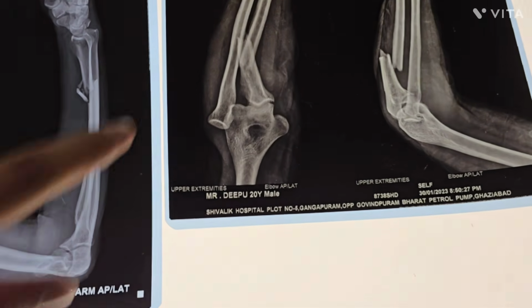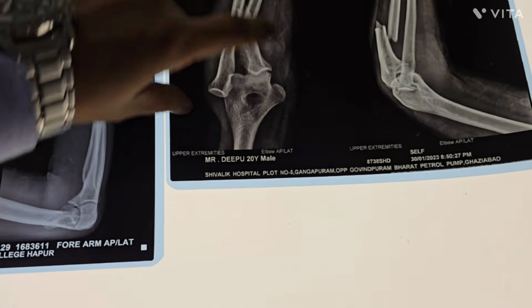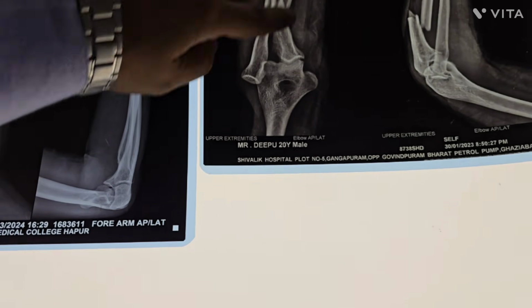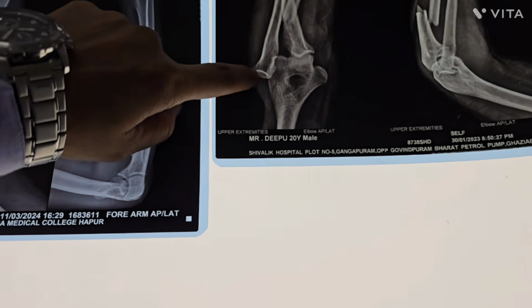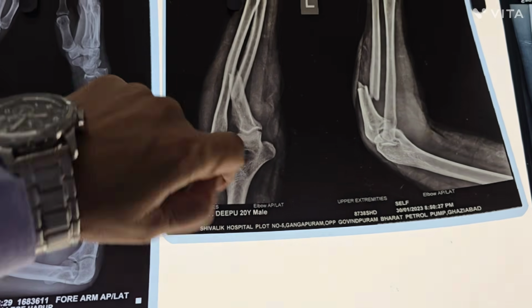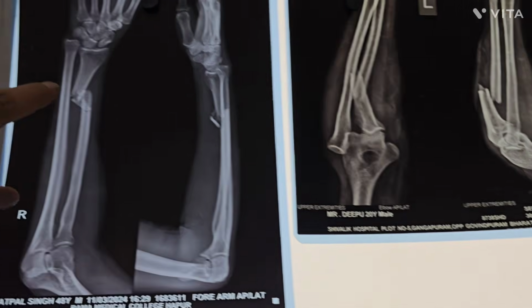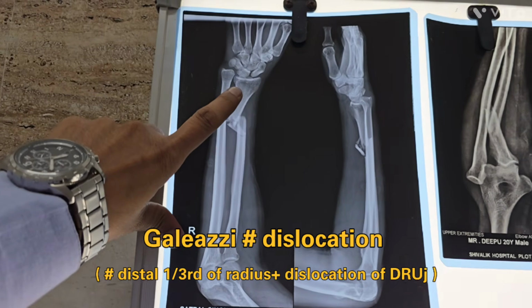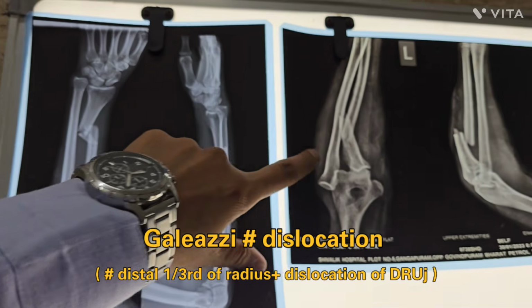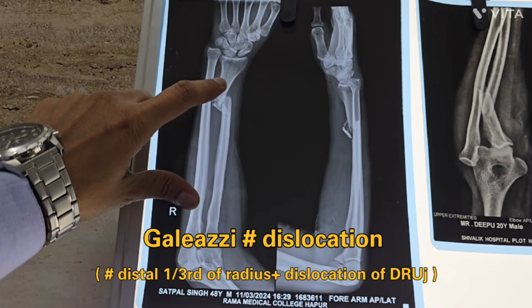Now the next patient, again you can see the distal part of humerus, this one is the ulna and this one is the radius, the radial head. The radial head is dislocated, the proximal 1/3 of ulna is fractured, and the treatment is the same. Now this one is the opposite of Monteggia fracture. This one is Monteggia and this one is a Galeazzi fracture.